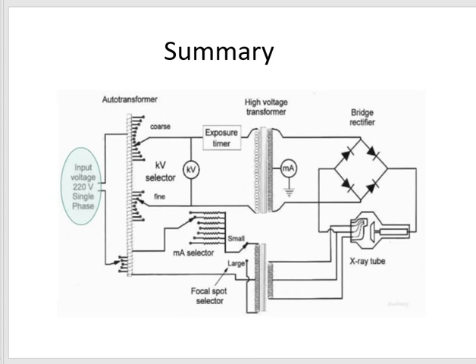In summary, these are the whole components that we have already looked at. We have the X-ray tube, X-ray generator, rectification circuit, transformer, AEC, the filament itself, the focal spot, how the filament affects the effective focal spot, anode heel effect, and anode target.